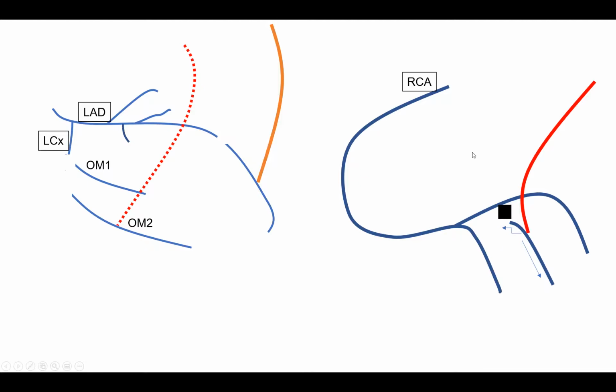Did everybody understand how this is really a very important idea? Did everybody understand how we analyze those cases, how we map the cardiac anatomy by juxtaposing the native as well as the graft filling, and how we report in terms of the three major territories? Do you want me to repeat that?